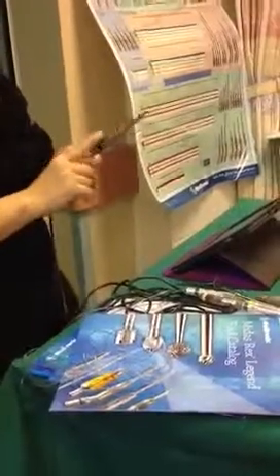It must be locked nicely, okay? And if the attachment didn't lock, the tools will get warm very fast. The attachment will get warm very fast. So that means you didn't lock it. And actually, it's always not safe if you didn't lock it.